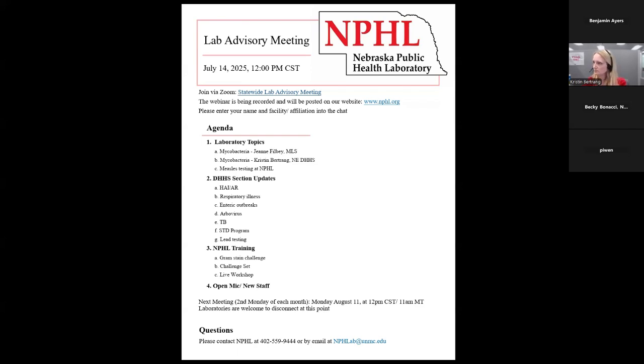I just wanted to add, so like you said, the amplified TB probe, the GeneXpert, that's why it's very important for physicians to be aware that that is there. It will detect that rifampin. And I think the numbers that we've had so far in our lab, I think at least one, if not two, detected by the GeneXpert, the rifampin resistance.